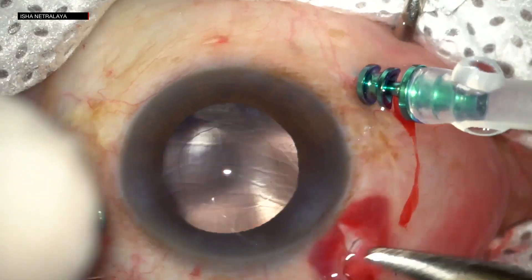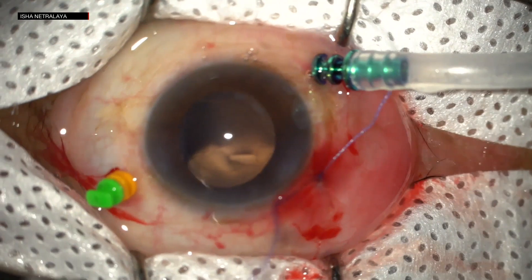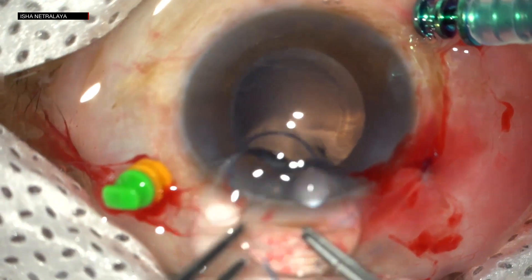In this case, triamcinolone acetonide was used to stain the vitreous. Again, the same phaco tip was used to emulsify the nucleus in the vitreous cavity. The corneal tunnel was fashioned and a three-piece rigid lens was placed in the sulcus.